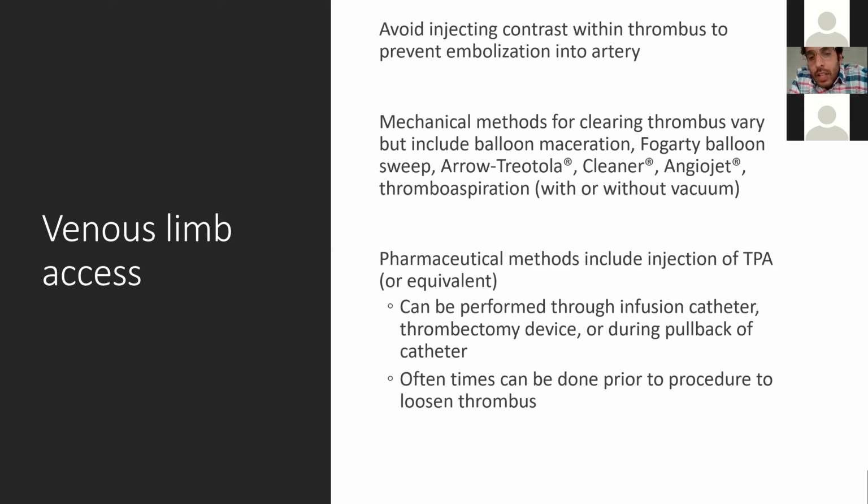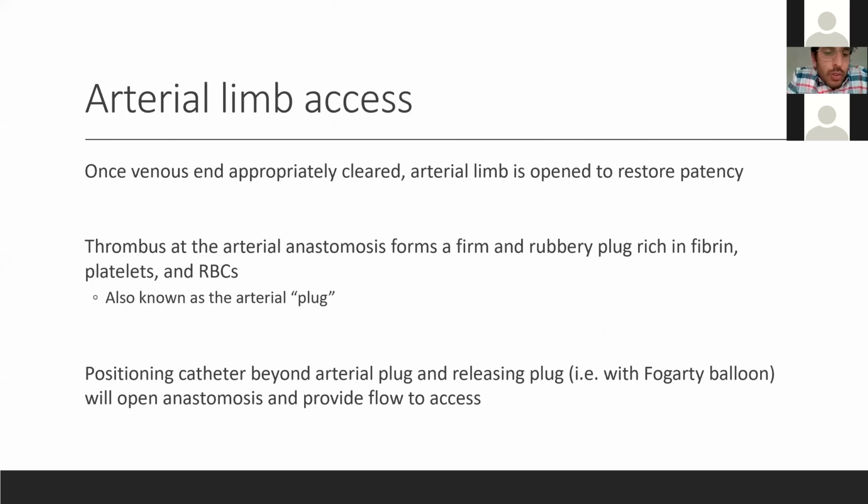In doing this talk a few times, I've encountered folks who do this and say it really works. So if you have that mechanism, obviously tPA works better the longer it dwells. So that's another kind of trick that you can consider.